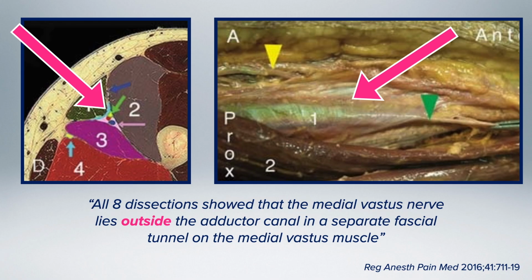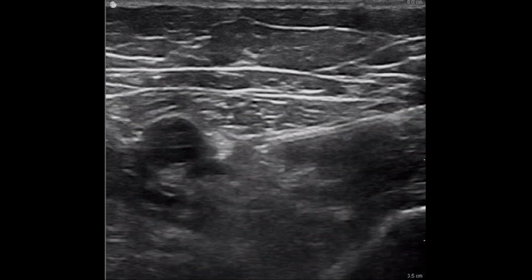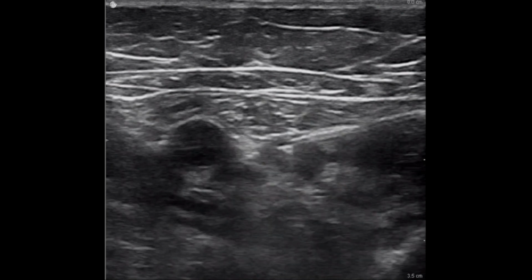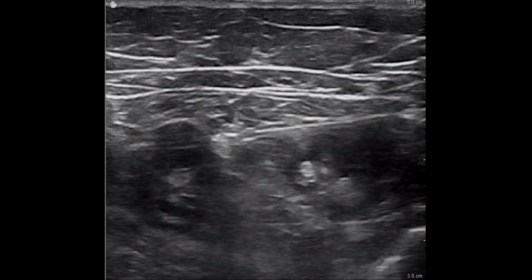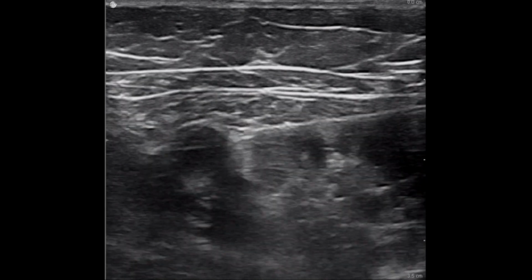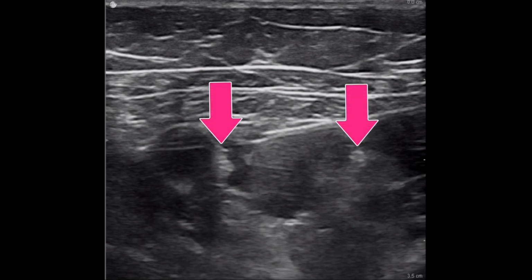Here's another part of the problem. There's a vastoadductor membrane that separates these two nerves. So if you're just going to put the local next to the artery, which is how I was taught to do this block, it's not going to spread well to the nerve to vastus medialis. So you have to separately block these two nerves, in my opinion. Here's an example of a needle coming across, and we've already started to expand this compartment with some saline, and you can see the nerve to vastus kind of being shelled out with the contrast from the fluid. And then we click, move forward, and pass through the vastoadductor membrane and get the saphenous nerve separately. And so there are two different nerves in two different compartments.